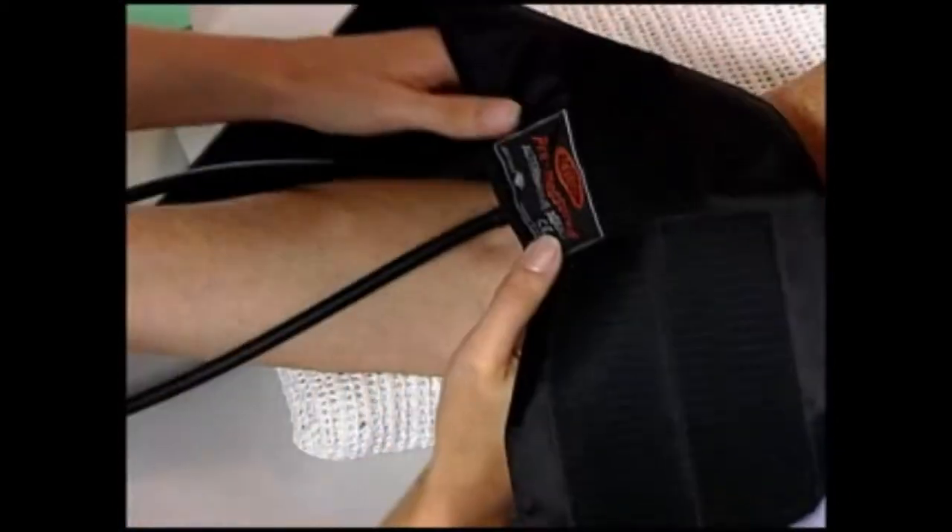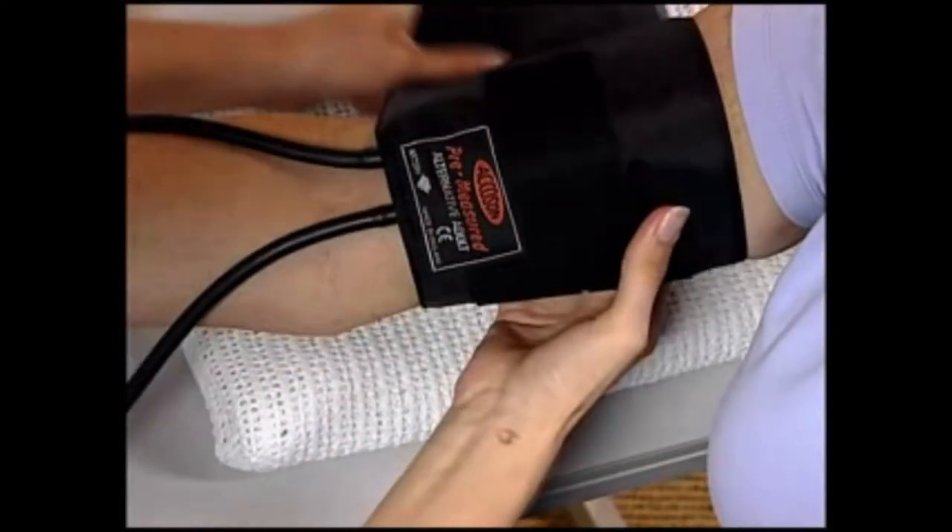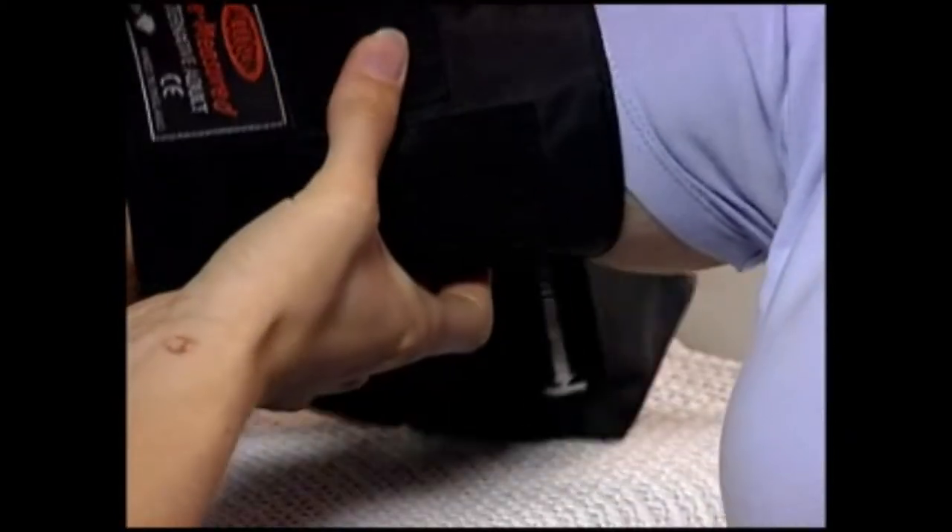When using the Akerson standard cuff, position the marked arrow that indicates the center of the inflation bladder directly over the brachial artery, leaving room for the stethoscope to be placed below the cuff. Close the cuff and make sure that its end falls within the limits of the rangefinder marks.